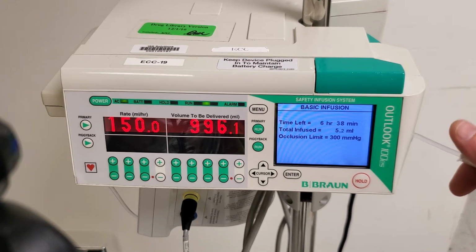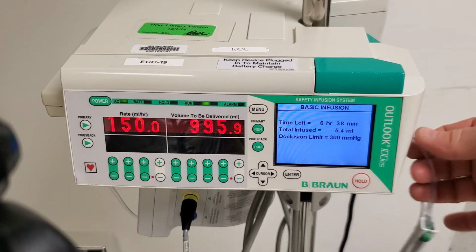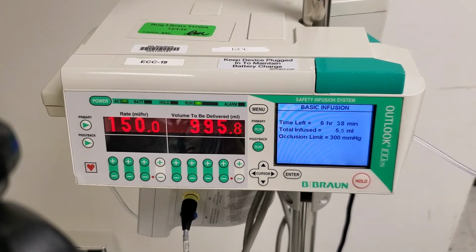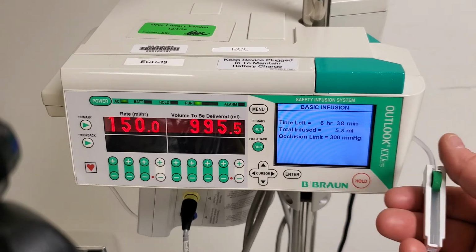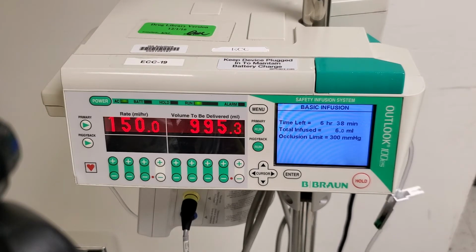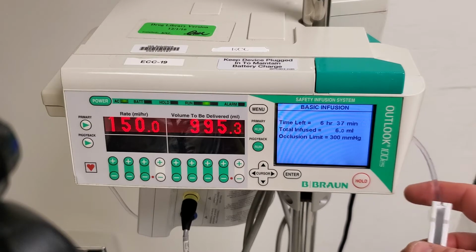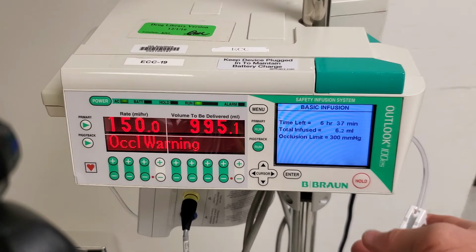Second kind of alarm that we can get is a downstream occlusion. So anything from the pump to the patient, including the patient, can cause this type of alarm. If we forget to open our roller clamp, if we get an occlusion in the catheter, if the patient bends their elbow, these are all things that can cause this type of alarm. Now when you first hear the alarm, if it's, say, the patient bent their elbow, the alarm goes off and the patient straightens their elbow, the pump will begin running again.